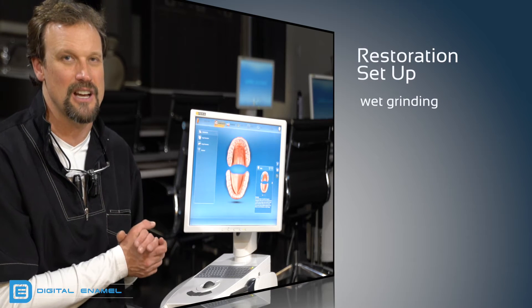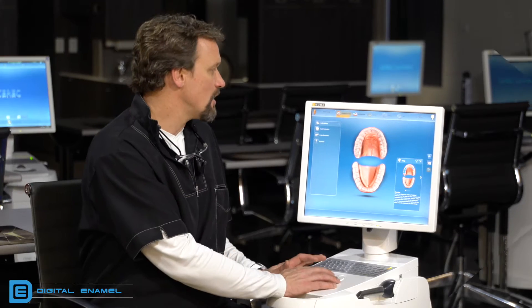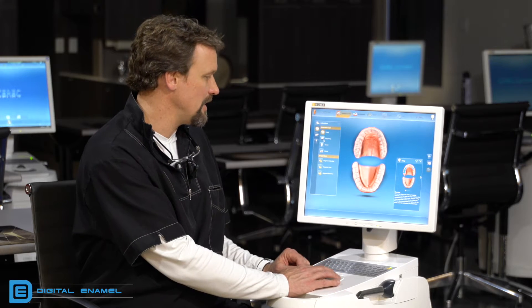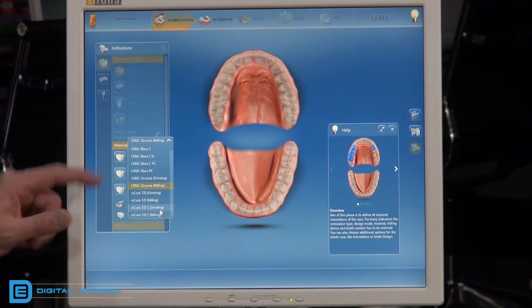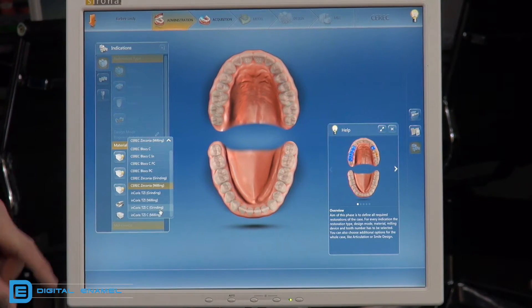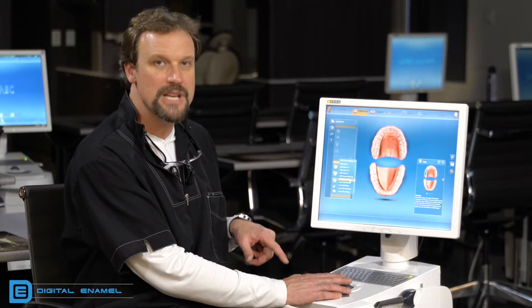When setting up the restoration, you have to make sure you're setting it up as wet grinding, wet milling, or dry milling. For a single restoration, crown is typically what you'll do with zirconia. Set up the design mode — biogeneric individual or biocopy. When you get down to the materials, you'll notice CEREC Zirconia milling and CEREC Zirconia grinding. If you have the new oven and the new milling chamber with dry milling and evacuation, you're going to select CEREC Zirconia milling. Then set up your milling chamber and tooth number.